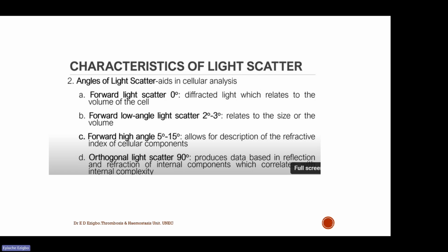So you can think of it, and even improve on it if you go into biomedical engineering. This is where you can put in your expertise as a hematologist and advise the engineers on how these cells behave, and they will know what technology to use and how they will be able to identify such things. So that is what happens in the engineering development of some of these instruments, so that some of you can actually find yourselves in instrumentation at the end of the day.